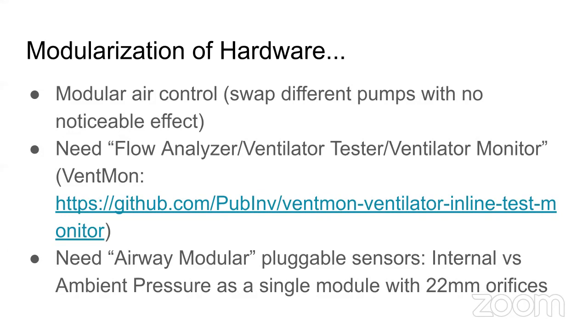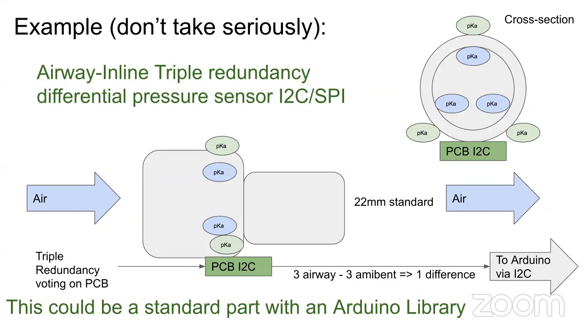It's even more important when we are making machines which have not gone through a lengthy qualification, quality assurance process, that we have that kind of monitoring as a backup. So this is just an idea. I don't want this to be taken too seriously, but David asks, how could the Arduino community play in this? This is an example of something that almost every ventilator project could use.